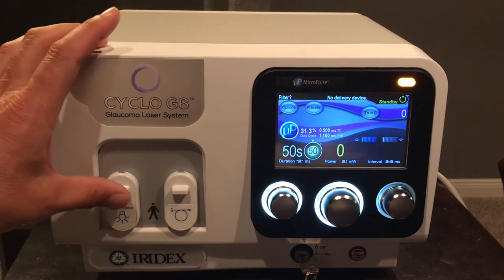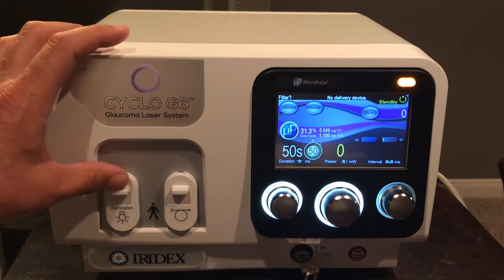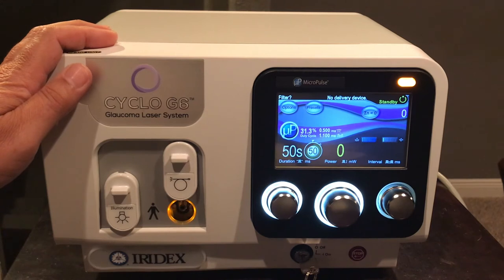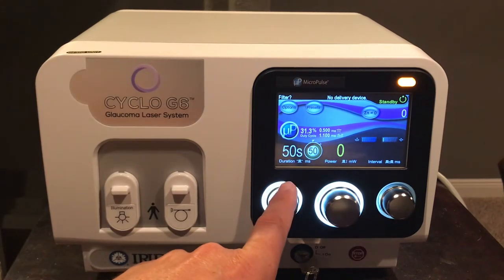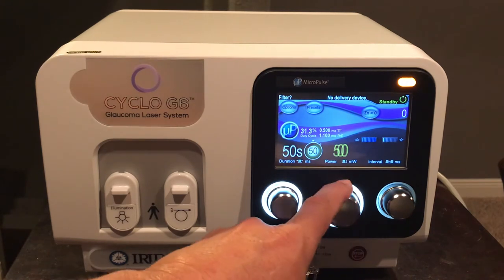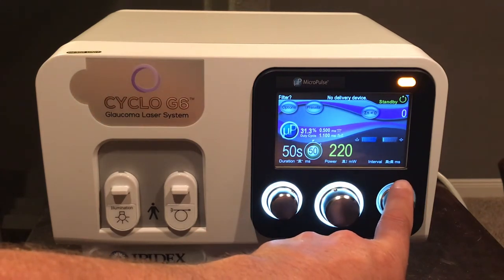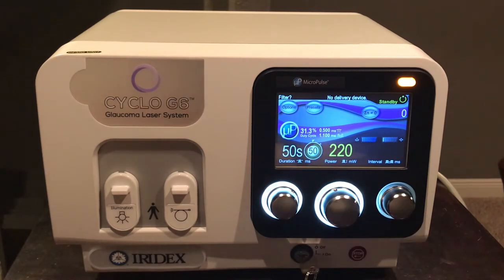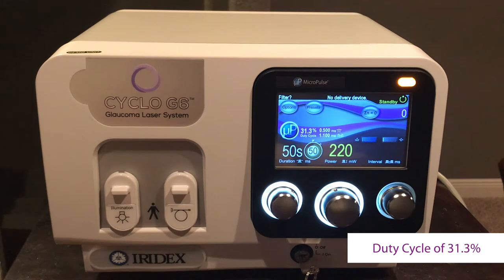Going from left to right, we have an illumination port, which is only used with an illuminated G probe delivery device, and then a laser port where the delivery device fiber is plugged in to deliver laser energy. The corresponding knobs control duration — the time of treatment the physician desires — the large center knob for power, and interval in milliseconds for how long each treatment pulse is delivered in micropulse mode. The duty cycle is set at 31.3 percent and is unchangeable.